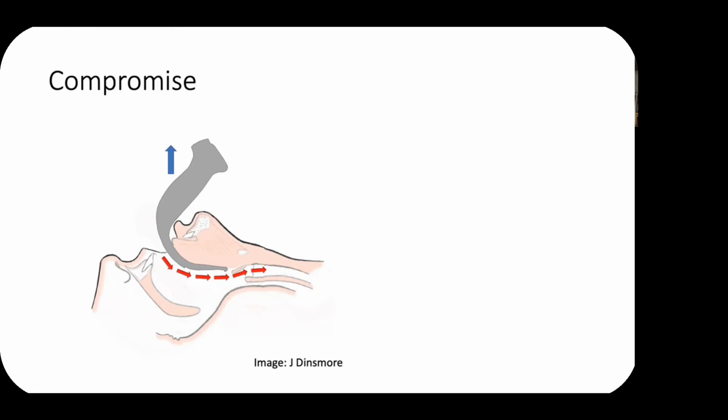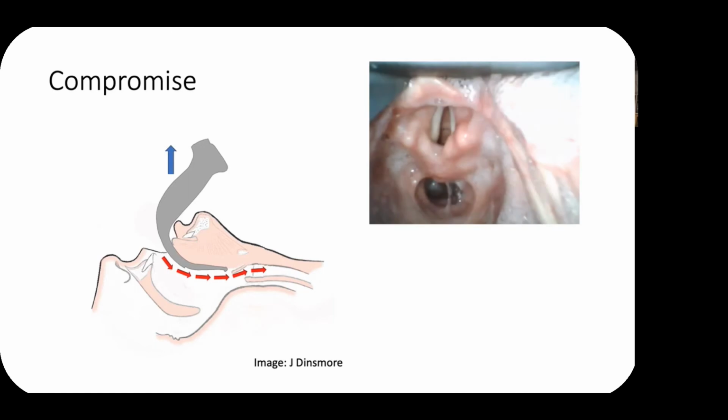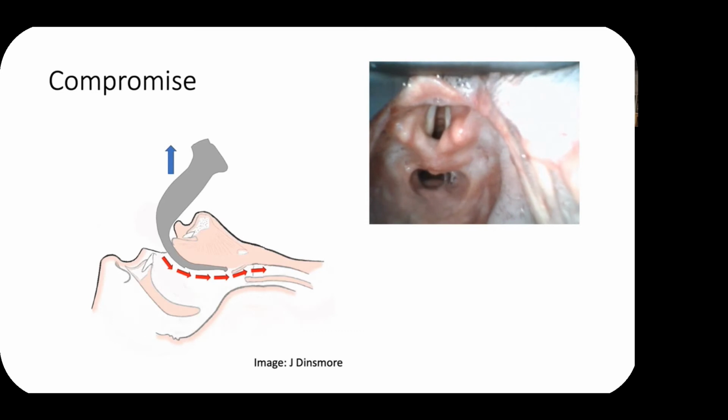What you want to do is to compromise the view in order to reduce the angle from pharynx to larynx. This involves dropping the blade tip so that it is parallel to the floor, and may involve retracting it out of the vallecula a little. You can see this being done in the video. When the alignment of pharynx and larynx is good, you see a black hole.